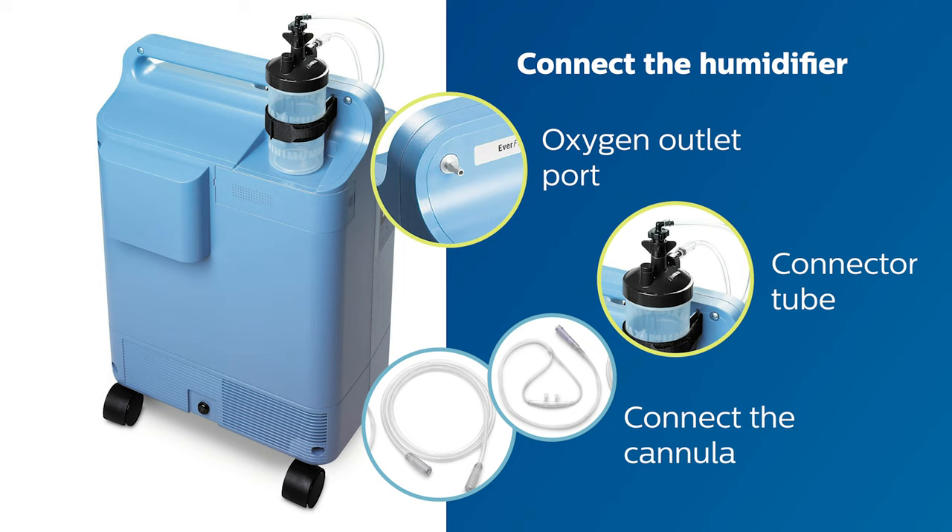If you are not using a humidifier, simply connect the nasal cannula to the oxygen outlet port, as shown here.